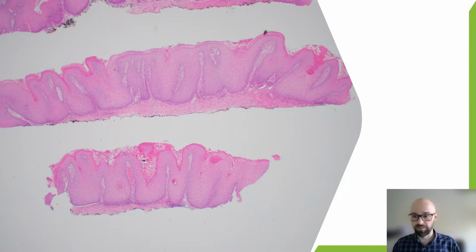So this is a typical example of a biopsy of a verrucous lesion, which is quite difficult. Even though it is quite a generous biopsy, there isn't really any adjacent normal mucosa to compare to. And so we can't really tell if there is deep pushing invasion or if this lesion is predominantly exophytic, in which case it would be verrucous hyperplasia rather than carcinoma.